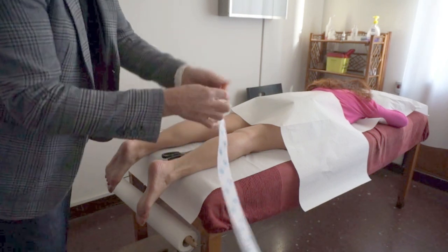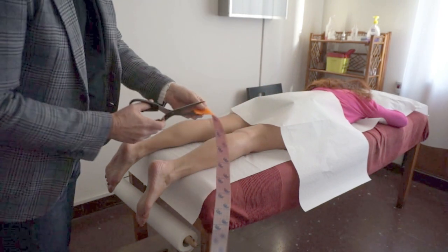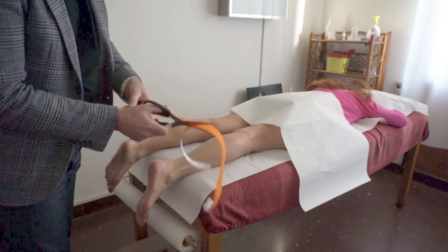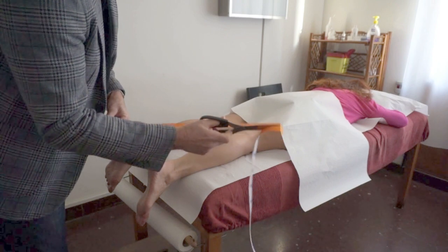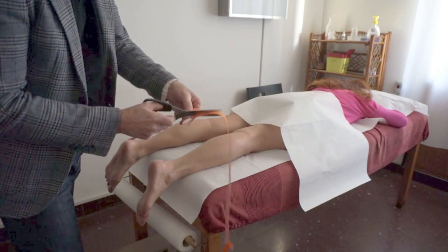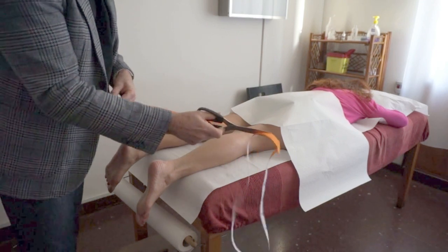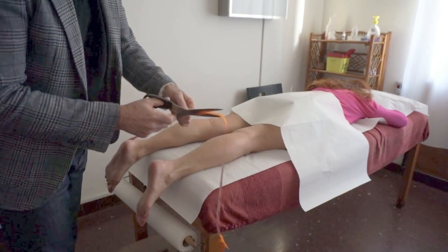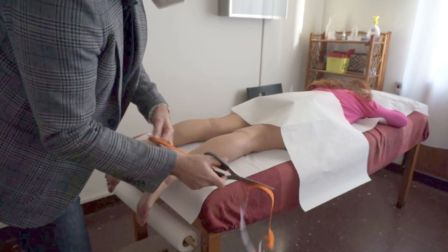We are going to be focusing on the lymphatic drainage from the ankle — internal and external — through the calf up until the popliteal fossa, to encourage lymphatic drainage of this area. The first step is to decide the correct length of the tape.